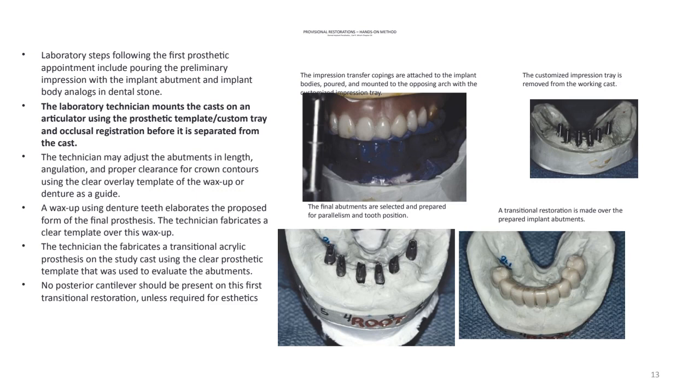Laboratory steps following the first prosthetic appointment include pouring the preliminary impression with the implant abutment and implant body analogs in dental stone.